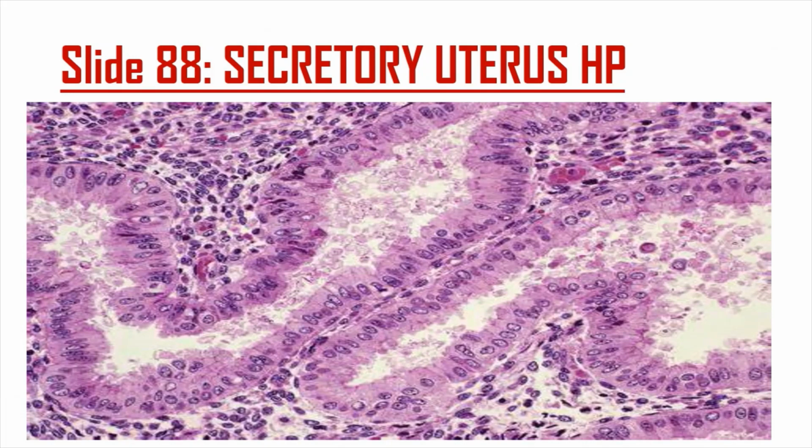So this is the gland here. And you can see the cells that are lining the glands. This is simple columnar cells. They are very dilated, and inside here there are glycoproteins, complexes that are being secreted by the gland. And this is another gland.